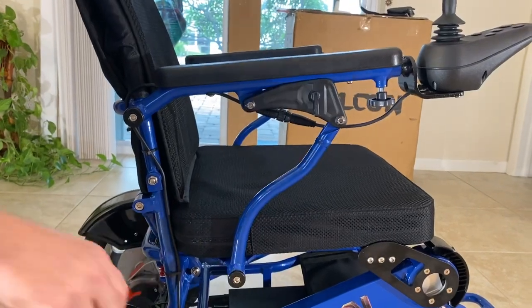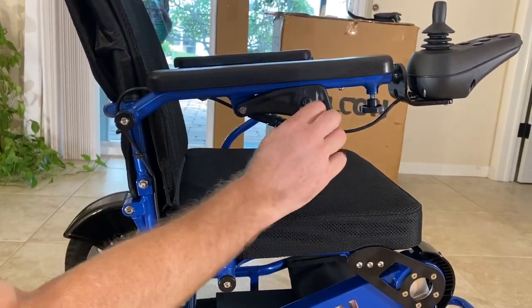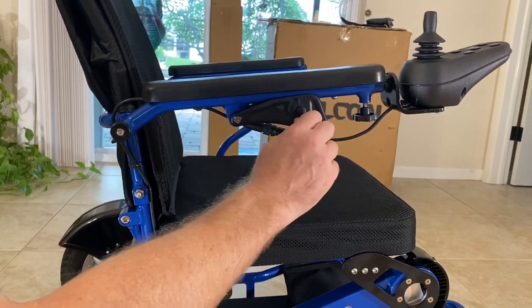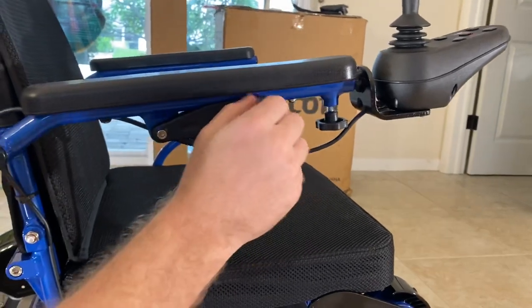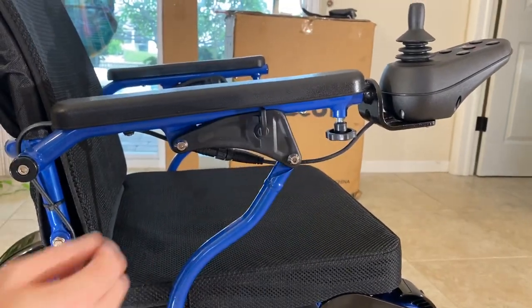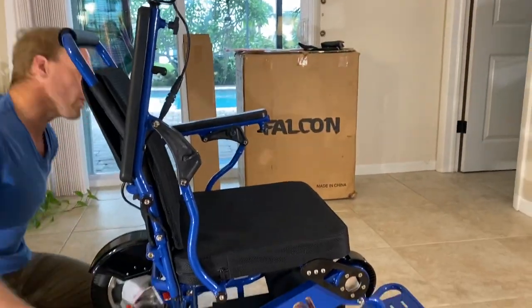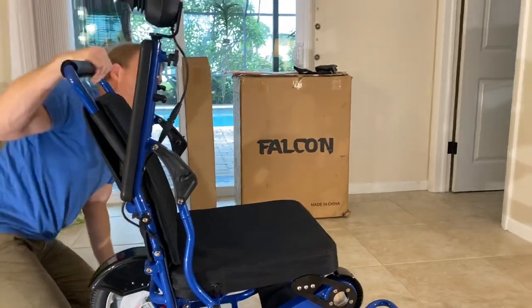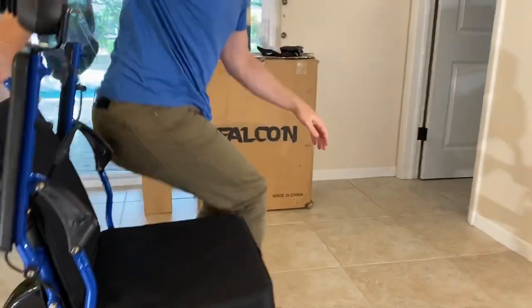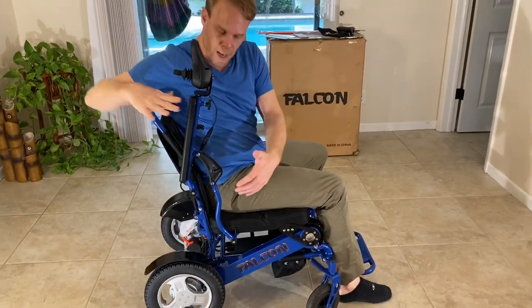Some people like to do a side mount or side dismount. This lever behind the joystick locks the armrest in place. I disengage that, turn it up, and then I can lift the armrest. The armrest comes up all the way. I have exactly the same thing on the other armrest, so it's very easy to do a side mount or side dismount.